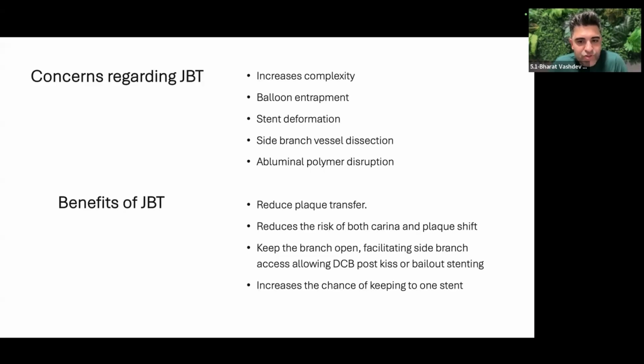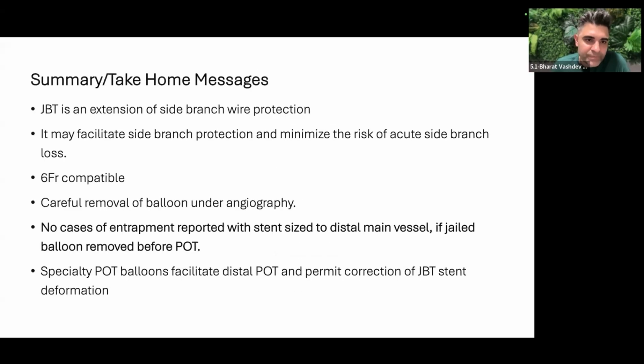What are the benefits? It reduces plaque transfer, prevents carina and plaque shift. It helps to keep the branch open. And it really increases the chance of just keeping to one stent and maintaining this provisional approach, which we know in the long term tends to portend good outcomes.